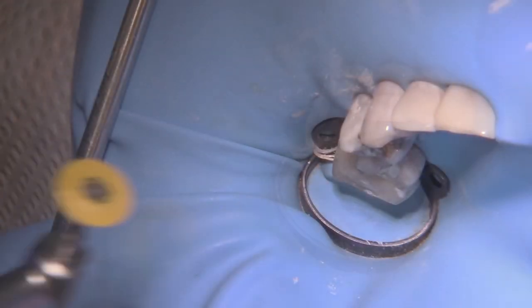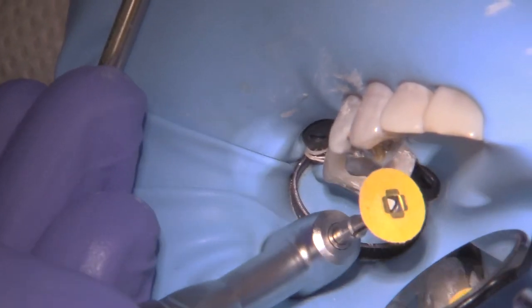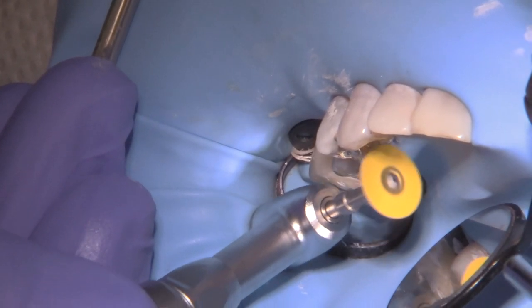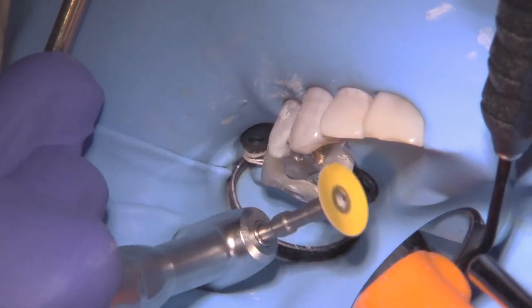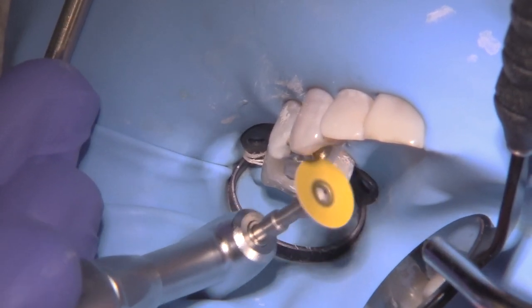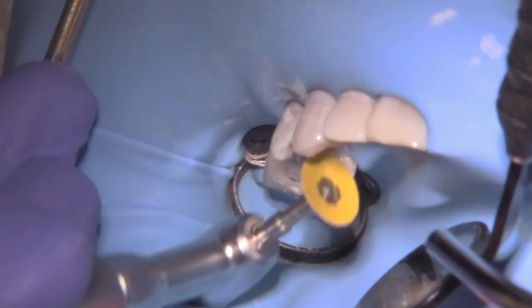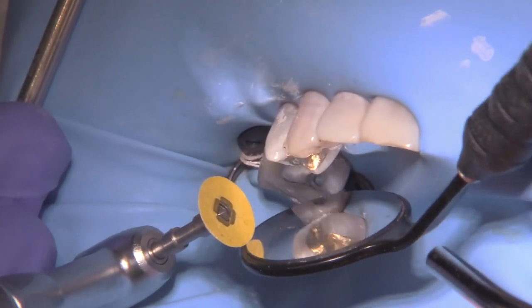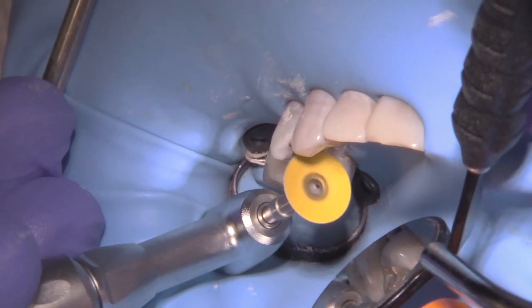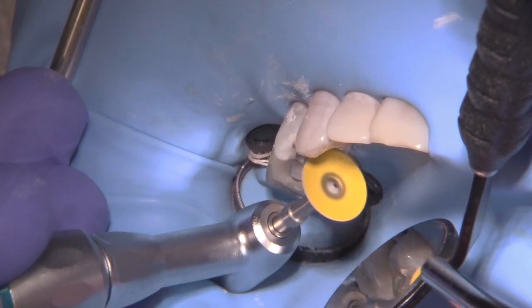Once finished with the disc in the straight handpiece, put it in the contra angle with the grit facing distally — towards the handpiece — when working on the mesial lingual, as you just aren't able to reach that area with the straight handpiece. Once you're satisfied that you've got the tooth and the gold to the same plane in all areas, you can check this with an explorer or just look at it to see the difference from where you started.